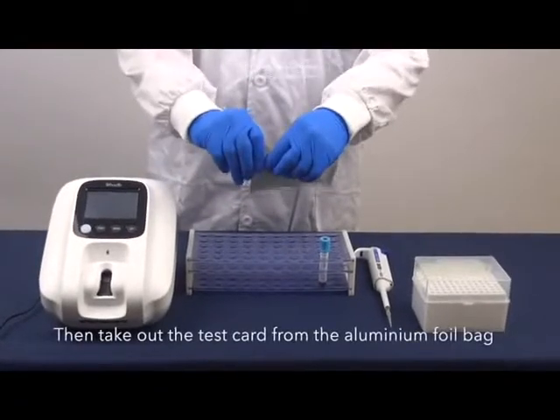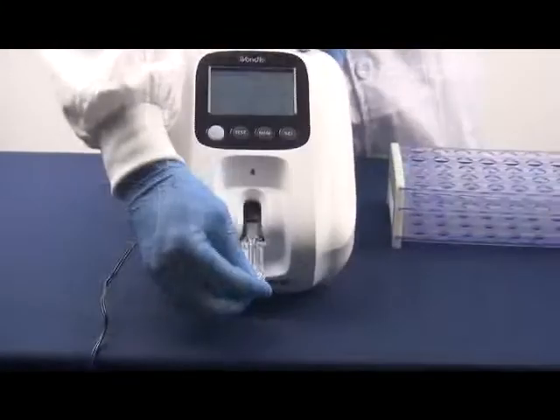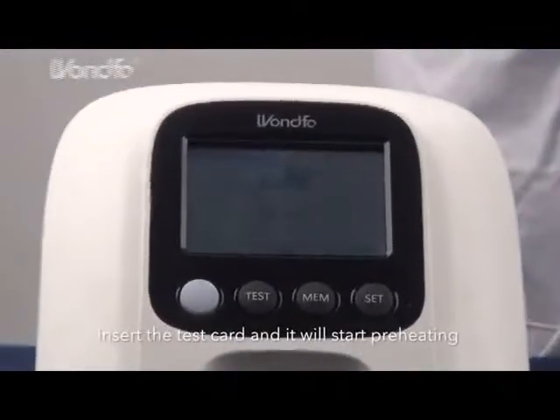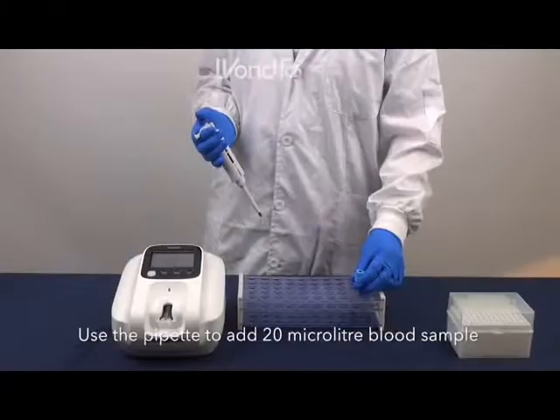Then, take out the test card from the aluminum foil bag. Insert the test card and it will start preheating for 25 seconds. Use the pipette to add 20 microliter blood sample.